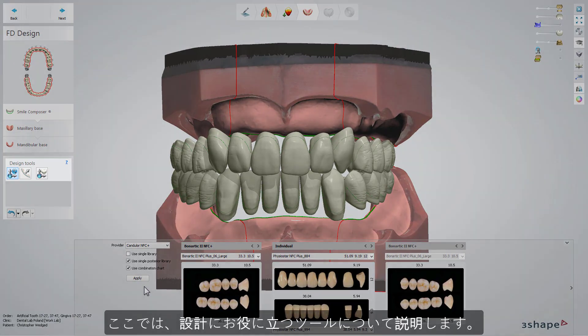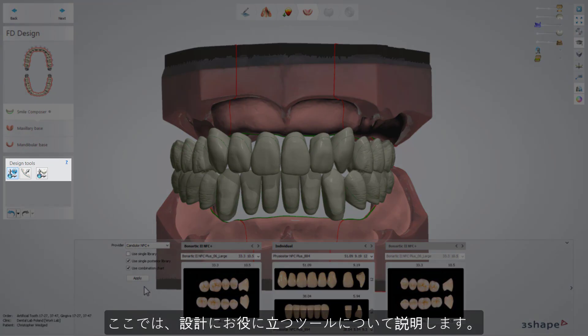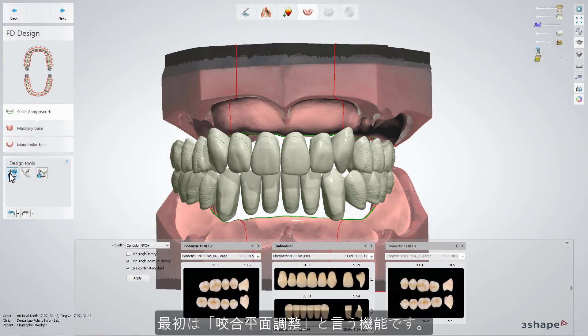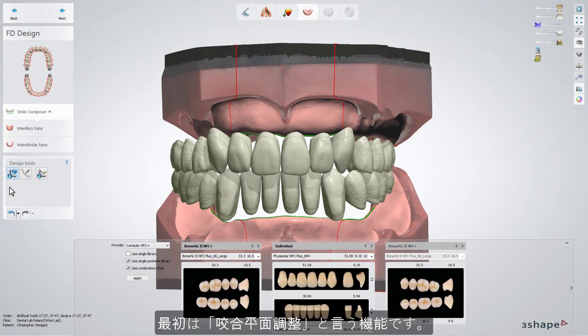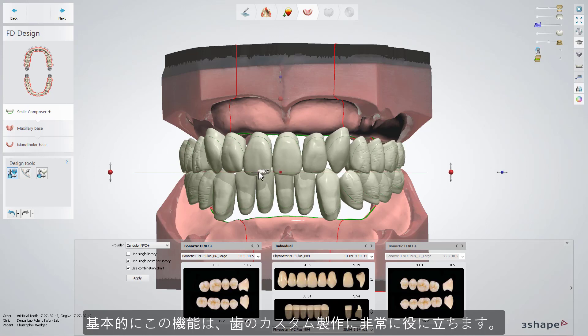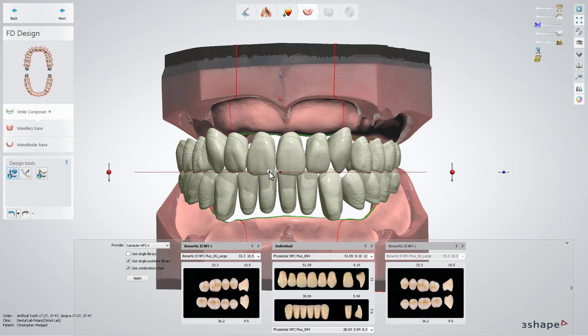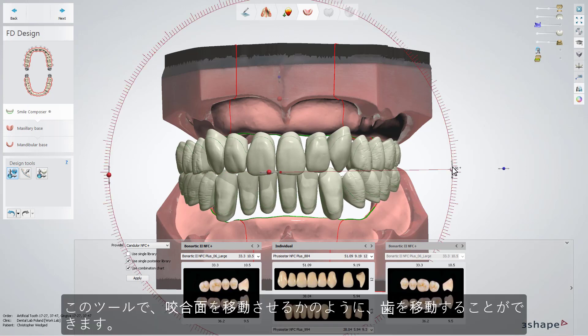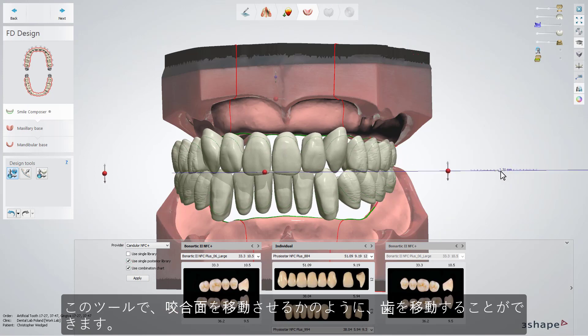At this point, we also provide a few more tools which will help you with the design. The first is Occlusal Plane Adjustment. This tool is very helpful when working on custom-made teeth. It will let you move the teeth as if you were moving the occlusal plane.